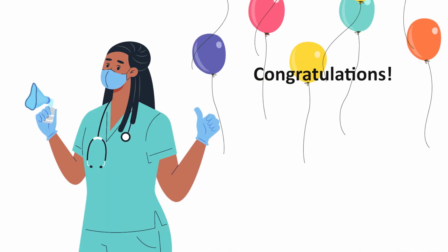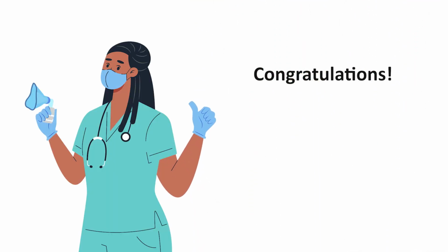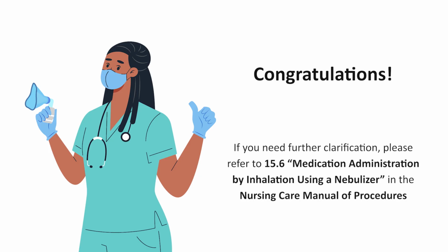Congratulations! You have now completed an administration of medication by inhalation using a nebulizer. If you need further clarification, please refer to 15.6, medication administration by inhalation using a nebulizer, found in the Nursing Care Manual of Procedures.